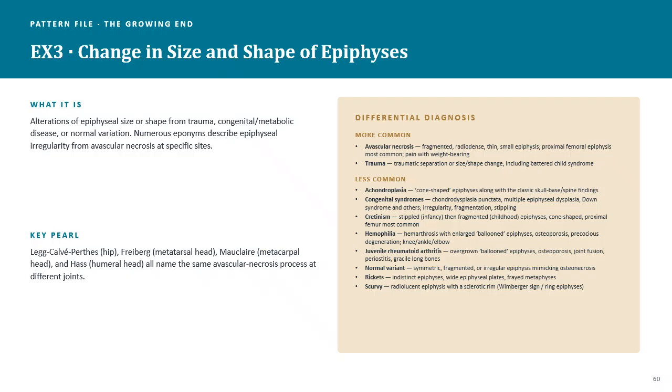When that epiphysis looks too small, irregular, unusually dense, fragmented or flattened, we start having to ask, or the doctor starts having to ask, what causes this appearance. They also might want to know what is affected as a result, because blood supply, development, and growth can be affected by an irregular epiphysis.